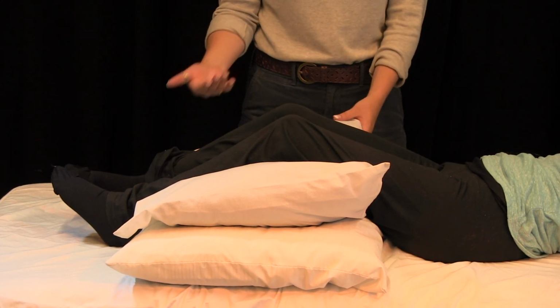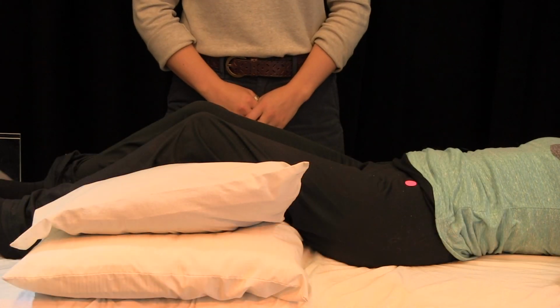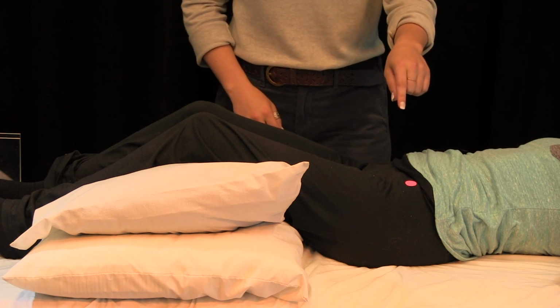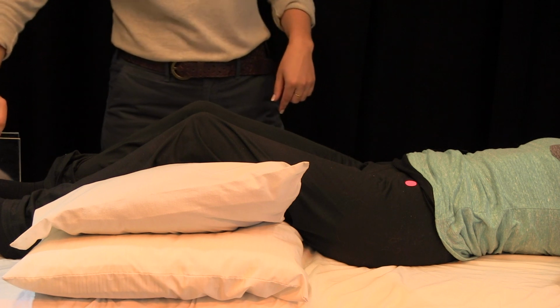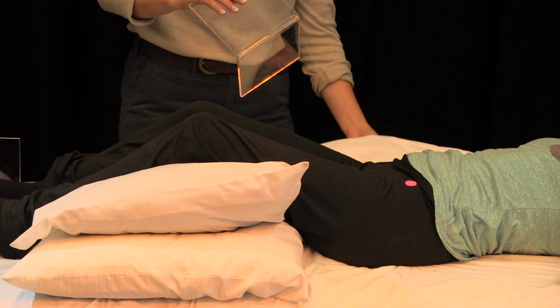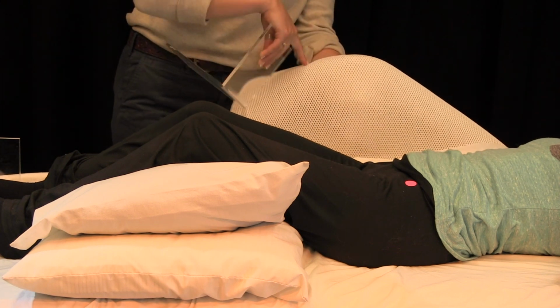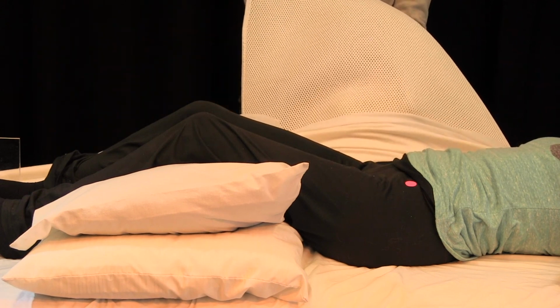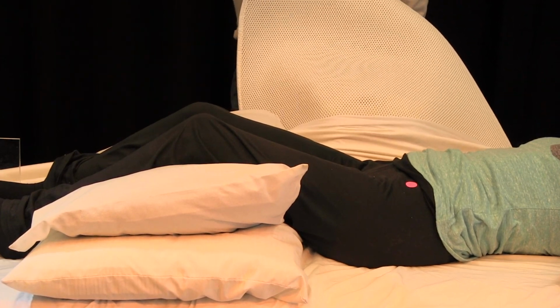To raise the height, simply add extra support under the knees and thighs. The first part of the body to be aligned is the pelvis. We have placed markers on Abby's pelvis to identify each ASIS. We will be placing lateral supports under the non-slip mesh and under the comfort cushion layer, and get them nice and snug against the hips here on each side.